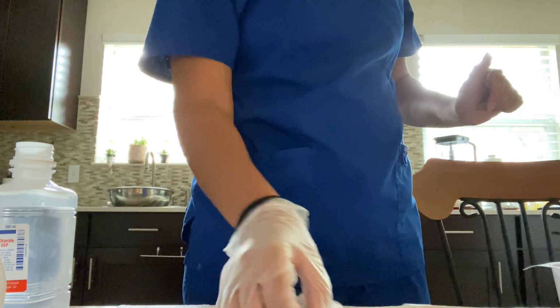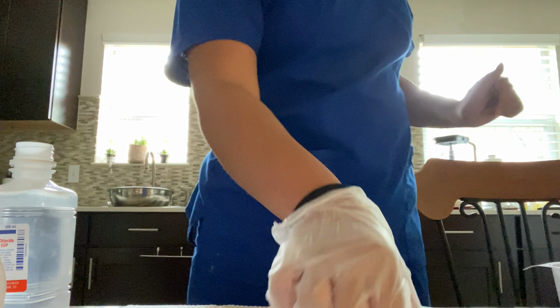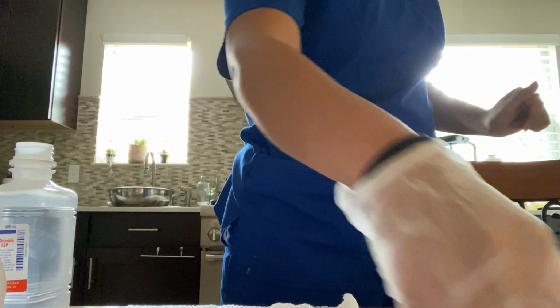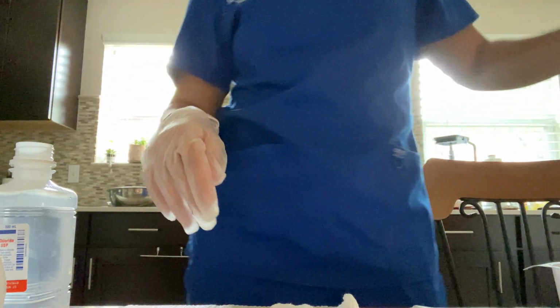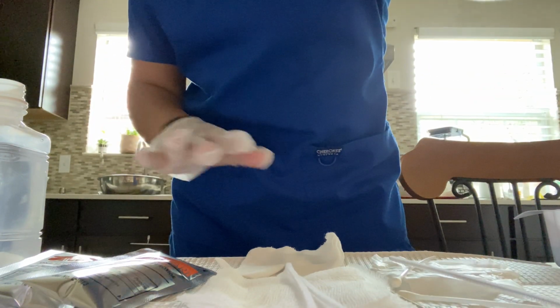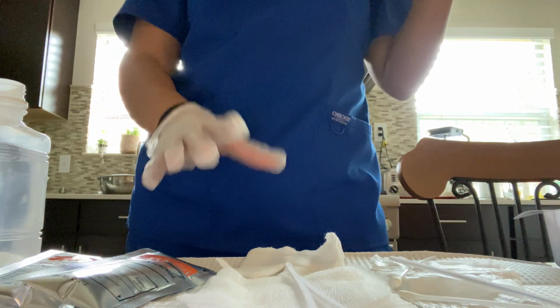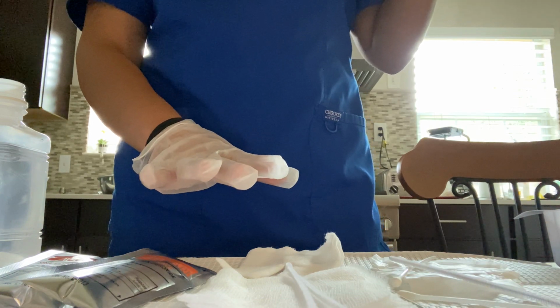Making sure it all stays, I'm not breaking sterile technique. I'm putting it all in there, on my sterile field. Sorry if you can't see it. I'm just going to put you a little lower so you can see it. Okay, perfect. I'm not breaking sterile technique. Okay, so after that, I put all of my stuff on my sterile field.